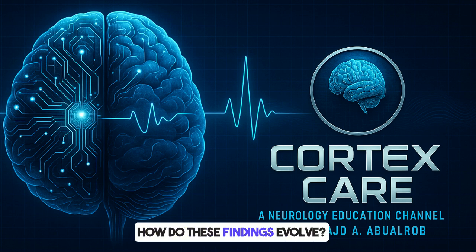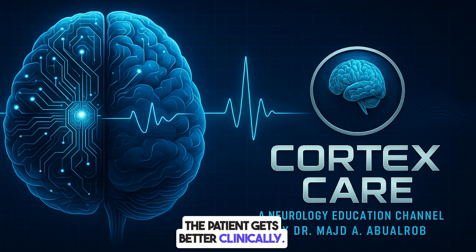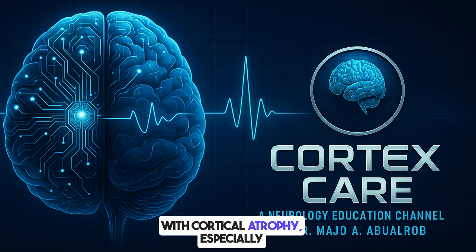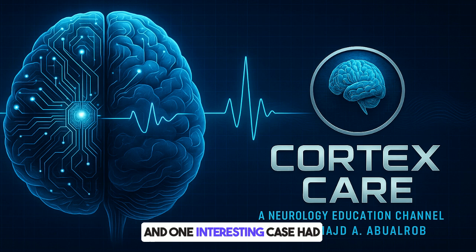How do these findings evolve? Do they resolve? Generally, yes. The imaging changes tend to resolve as the patient gets better clinically. But any residual changes? Some cases can be left with cortical atrophy, especially in the temporal lobe. And contrast enhancement in GABA B? Not typical. Yeah. A few cases showed weak temporal enhancement. One reported meningeal enhancement, and one interesting case had that long spinal cord lesion, LETM, in the thoracic spine.